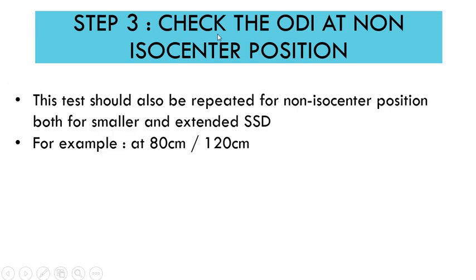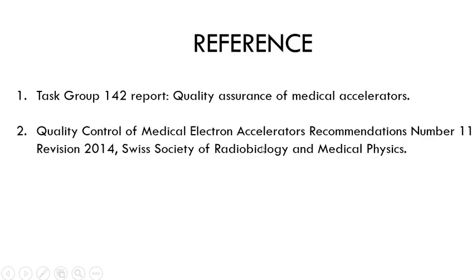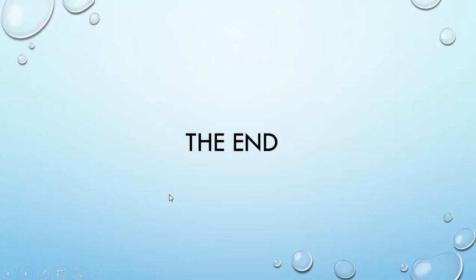You should also perform the same check at non-isocentric positions. If you have a device calibrated 20 centimeters up or 20 centimeters down, you can check those as well. You could also use a stack of plastic phantoms of known distance to check for a smaller SSD and an extended SSD. That's the end of the video — thank you.